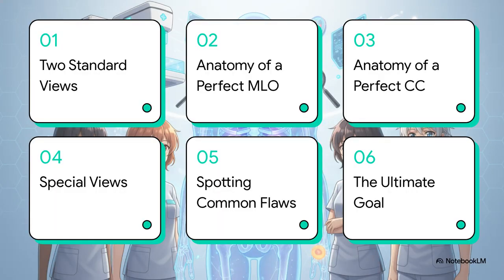All right, so here's our game plan. We'll kick things off with the basics, the two standard views, and then we'll break down exactly what makes a perfect image for each one. After that, we'll look at some special cases, learn how to spot common flaws, and then finally, we'll tie it all together to see why all this precision is so important.